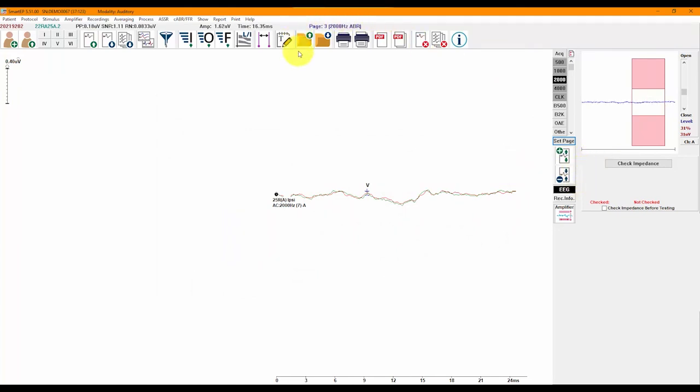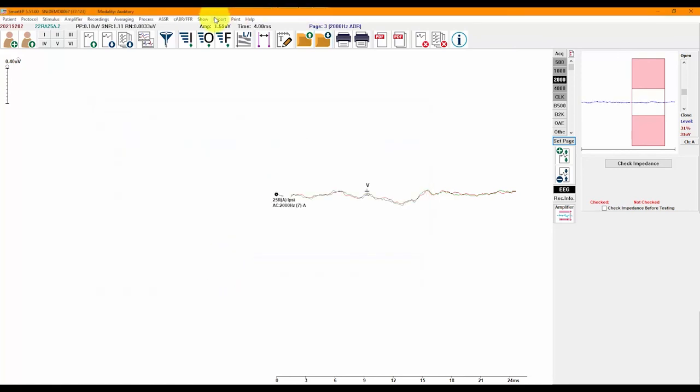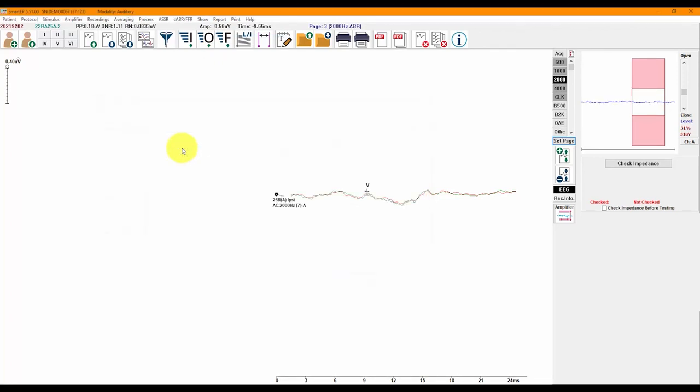Before ending your session, even if you have not finalized your report, it is important to save your report. This will allow you to load the report and have all of your pages populate as you had left them. To save a report, click on the save report icon or click on Report > Save Report. The report will already be saved in the patient record, so more commonly our users use the date as the report name and save.